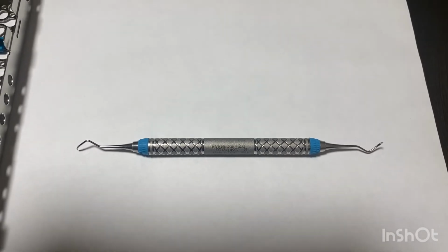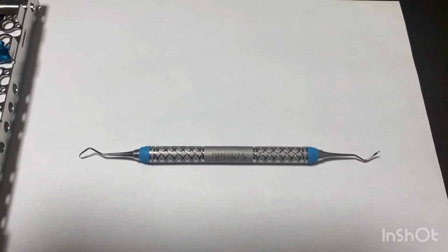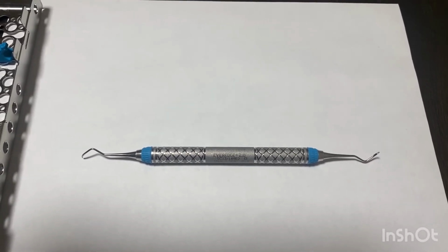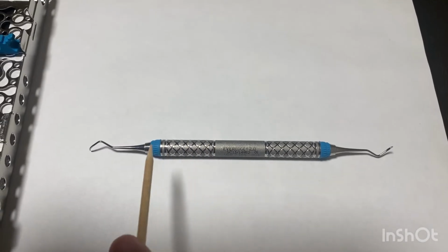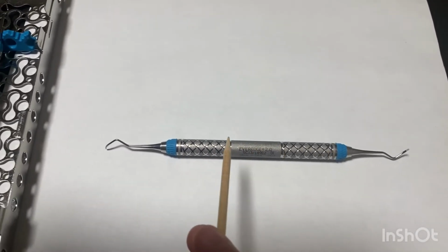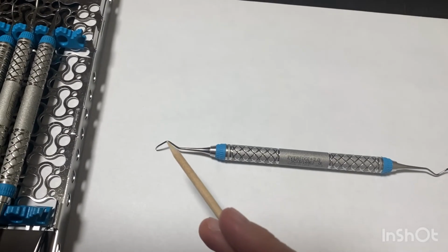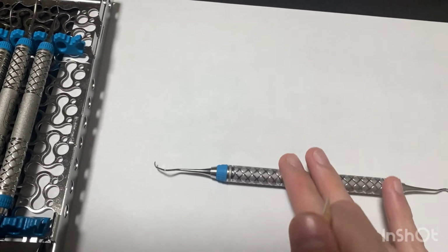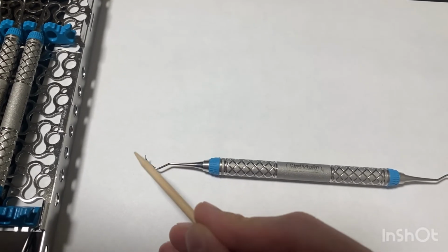The Columbia Universal Curette is an instrument that may be used in all surfaces of the teeth for both anterior and posterior teeth. So in this instrument we have the handle, the functional shank, the terminal shank, and we have the working end right here.